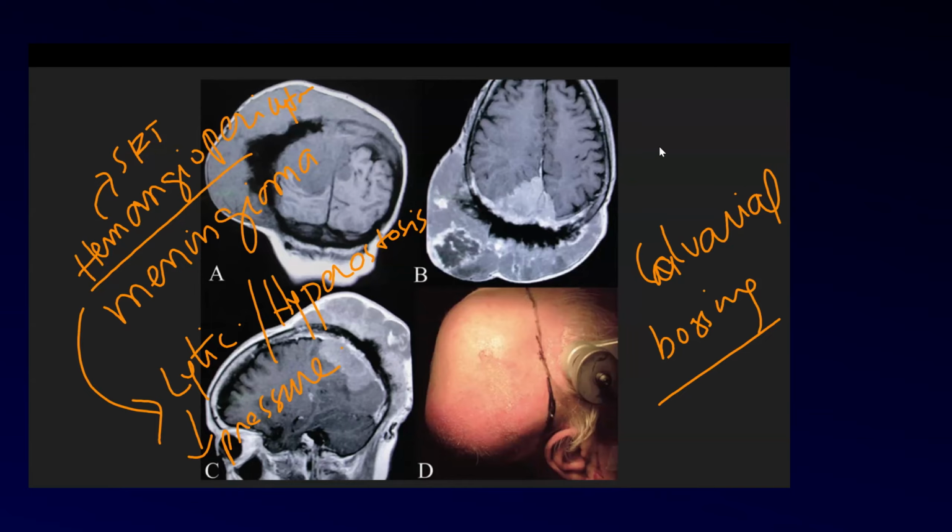Usually, meningiomas cause hyperostosis. The only situation where a lysis is going to be visible is when the meningioma was long standing. There were significant pressure symptoms, and the calvaria just gave way to it. So, also the history is very suggestive. Meningiomas usually have a longer history. Hemangiopericytoma have a relatively shorter history.